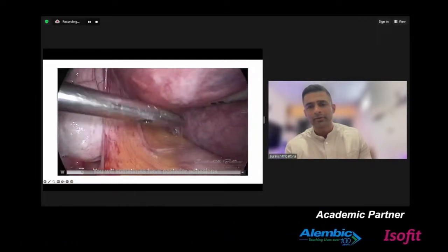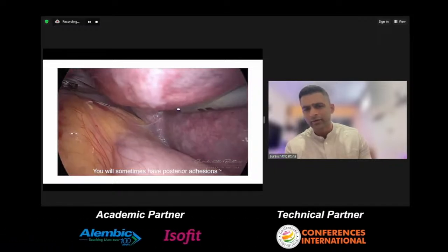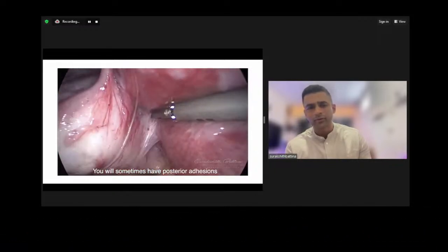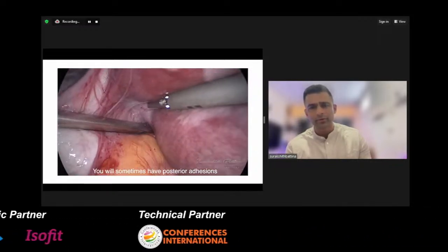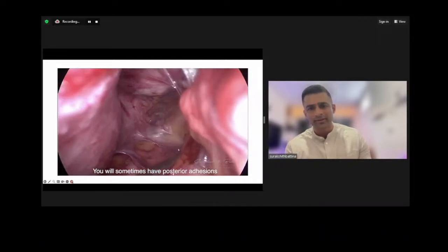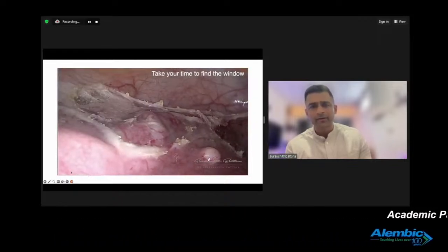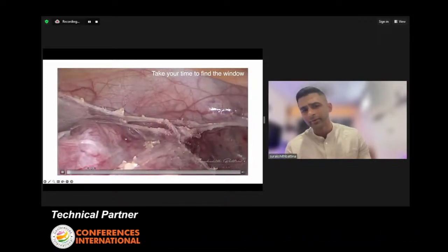Again, if you have posterior adhesions like these flimsy adhesions, and most of the time it's flimsy adhesions only, you can definitely go dissect them off first before you go ahead and place the stitch. Because if you don't do this step, you're going to have some challenge in trying to place the stitch later. Right. Again, take your time in finding the window because it's very, very important, because sometimes you'll have bleeding.